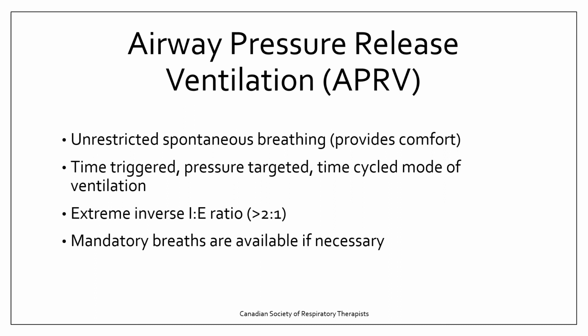So the way this mode works is we have a high pressure and a low pressure, and we spend a certain amount of time at our high pressure and a certain amount of time at our low pressure, and the patient can spontaneously breathe at any time during the cycle.